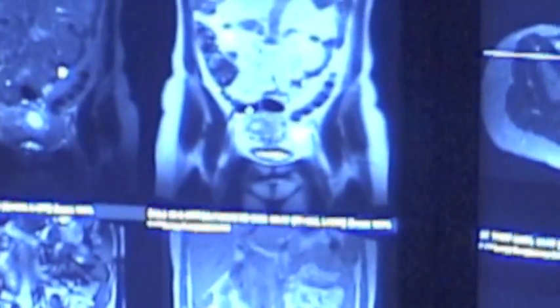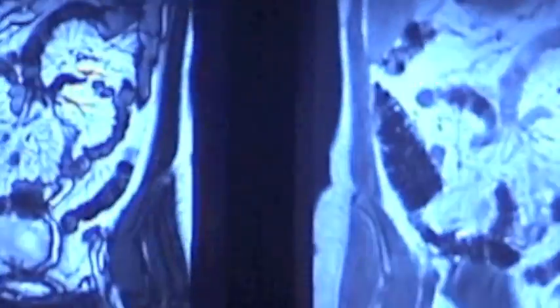To specifically find the appendix, I move to the Haste images without inversion recovery and fat suppression, rolling through them in the coronal plane first. I tend to find the appendix much more quickly on coronal images than axial images. Here's the terminal ileum diving into the ileocecal valve, so we know this is the cecum — the appendix should be somewhere in this region. I'm not seeing one, so if we do find it, it's not pathologic — it's normal.